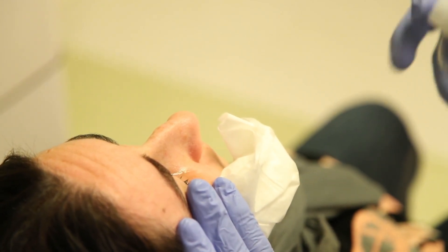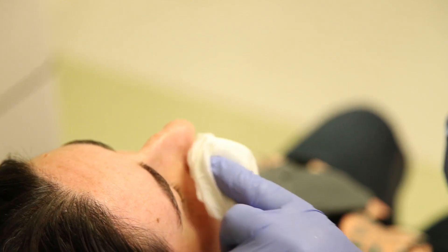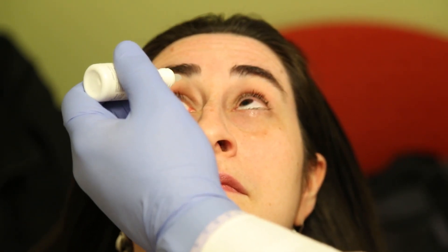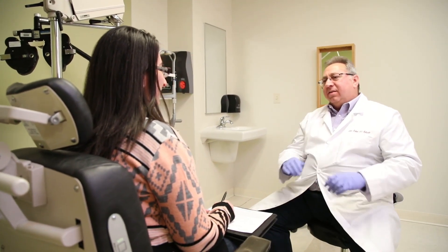Thoroughly rinse the eyes and eyelids with sterile buffered saline solution, being careful to prevent excess fluid from running down the patient's face by using clean tissues or paper towels. Following the procedure, some doctors instill a drop of topical antibiotic steroid combination solution into each eye as prophylaxis. It is typical to schedule a follow-up visit for patients in two to four weeks. Patients should be encouraged to continue any home therapy, including the use of artificial tears, lid scrubs, and warm compresses as needed.